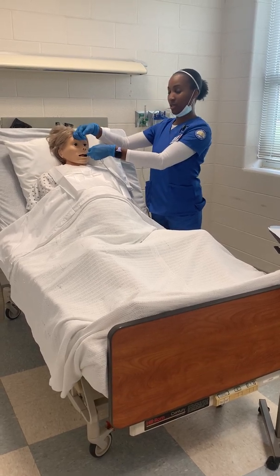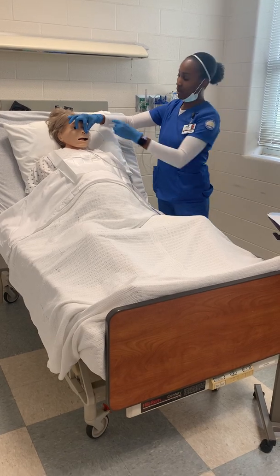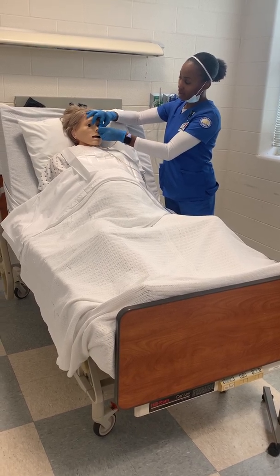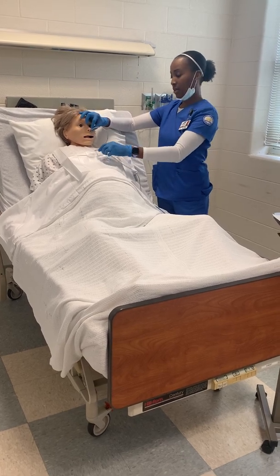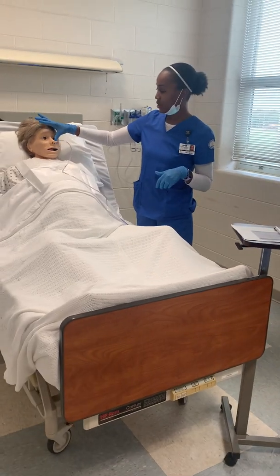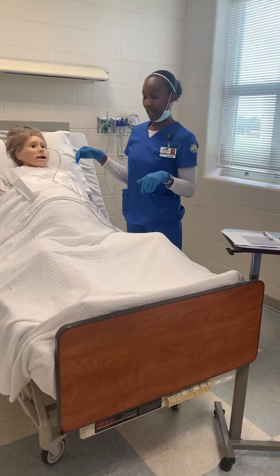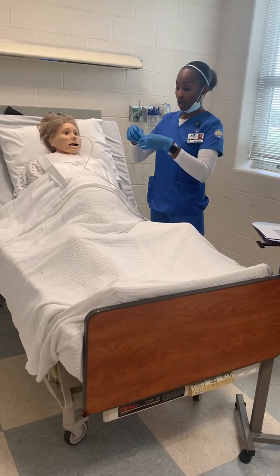And it's at the predetermined mark. I'm going to hold it and temporarily secure it. So while it's there, I'm going to either check pH of the stomach contents or get an x-ray to confirm placement. Once I've done that, then I can go ahead and secure it.